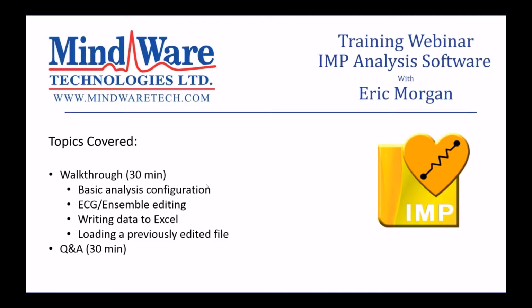So some of the topics we're going to cover: basically the webinar is going to be split into two main parts. There's going to be a walkthrough segment that's going to last about half the duration of the webinar, and we're going to go over things like the basic configuration of the analysis application. We're going to look at the analysis screen, what sort of parameters are being shown on that screen, and some of the graphs that are shown.